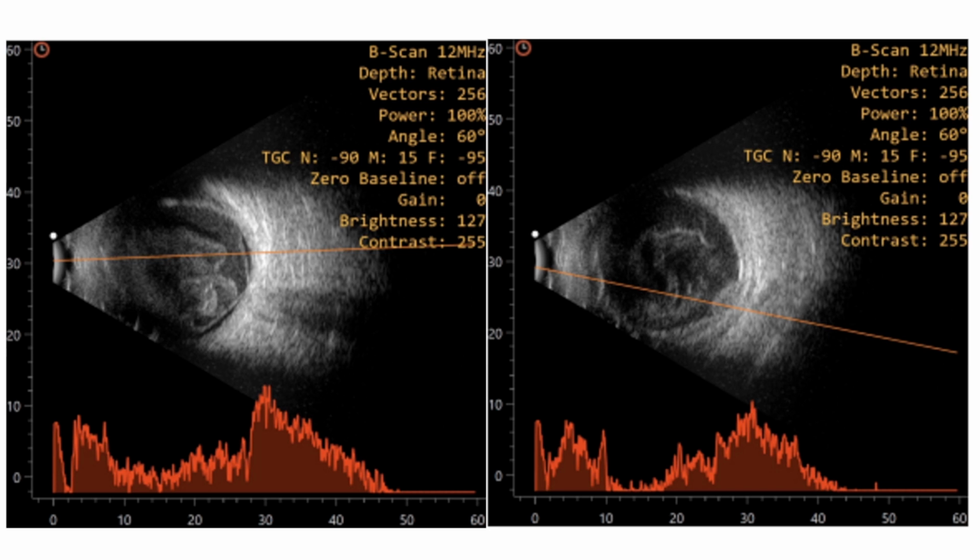Why do you call that IPVD? Because when the vector is passing through the upper one, it's a moderate spike. What else? All those echoes are in connection with that membrane.